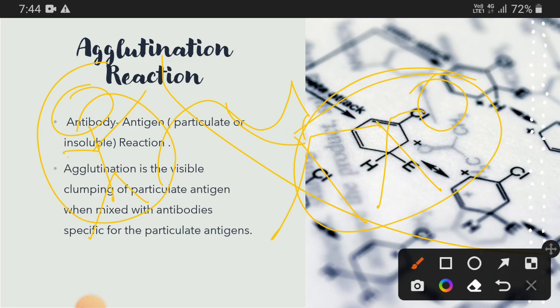We then extract those antibodies, and they can be used as a secondary antibody in the Coombs test. Remember, this secondary antibody binds specifically to the Fc portion of the antibody, leaving the Fab portion free to react with the antigen.